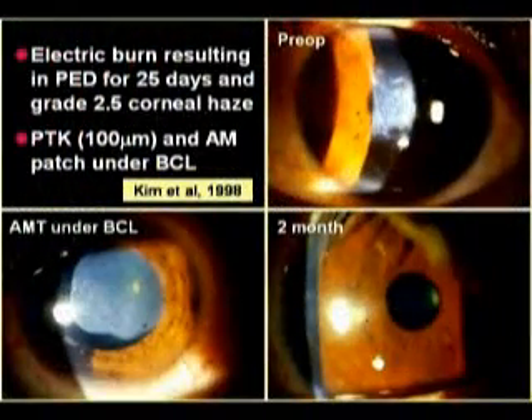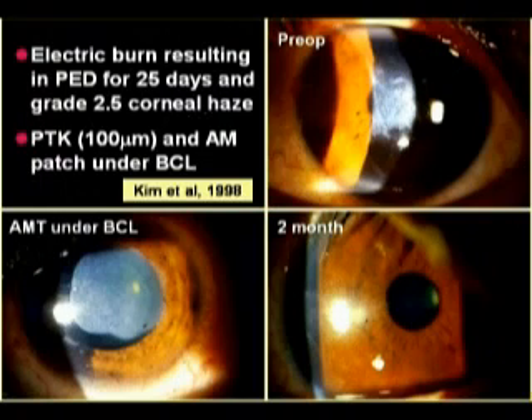This is another case contributed by Dr. Kim, where he performed a PTK on an eye which had developed cornea haze following an electric burn. Following the PTK, he placed an amniotic membrane on the right eye, which was secured by a bandage contact lens. Two months later, this area shows minimum scarring.